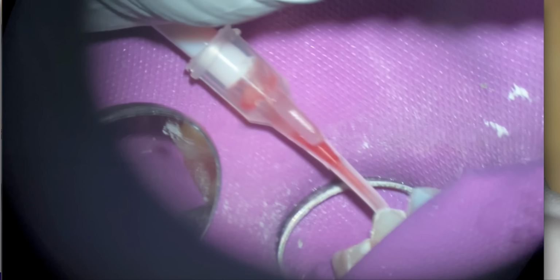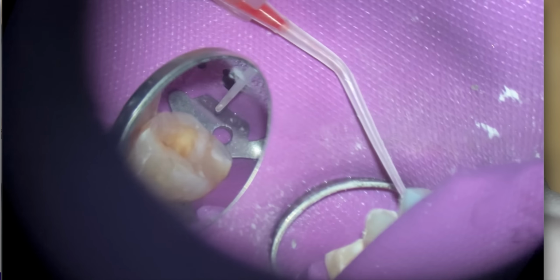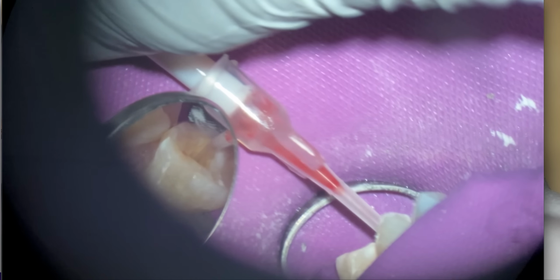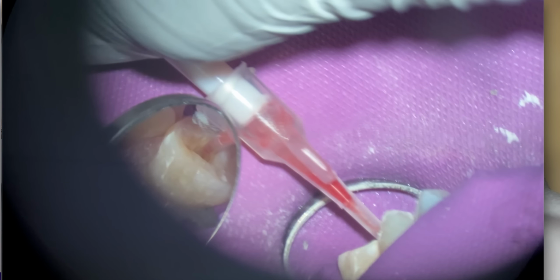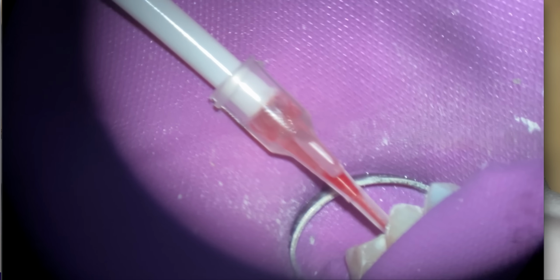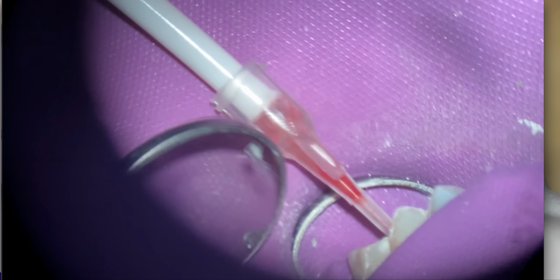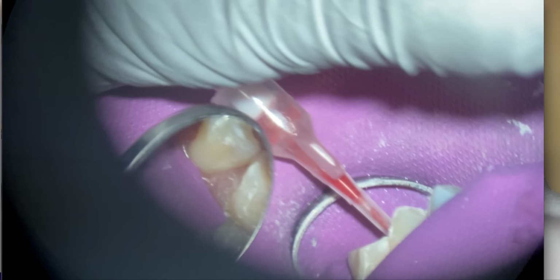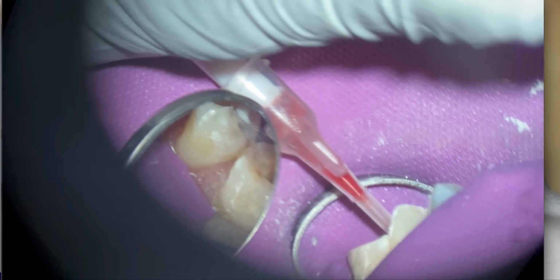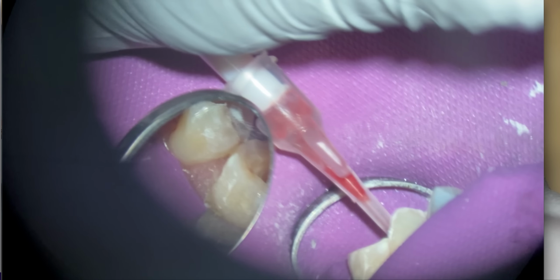And then boom, all this material came flying out. And I was like, whoa, what happened here? Maybe I'm just decompressing the cyst slowly. I don't know, who knows? But after that happened, it stopped flowing. There was no more drainage after we did this. So I don't know. We'll see. What do you think?